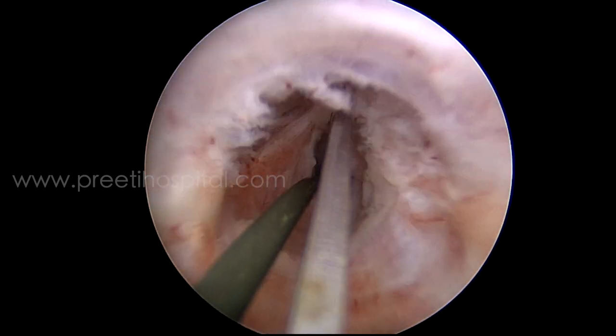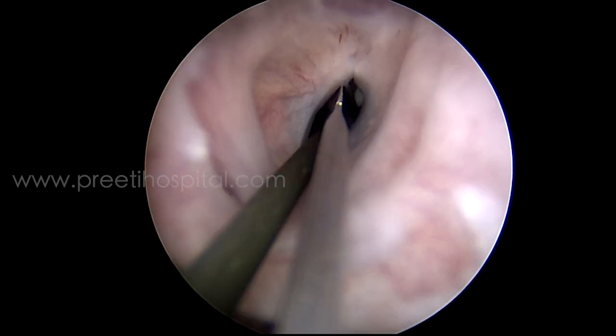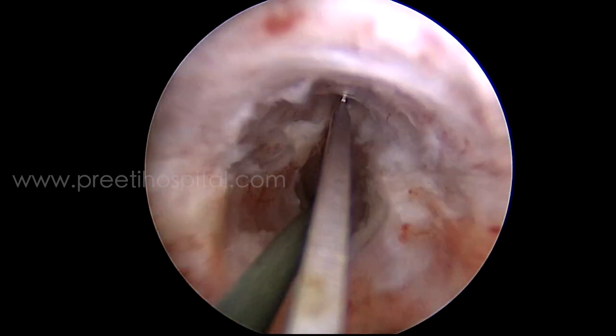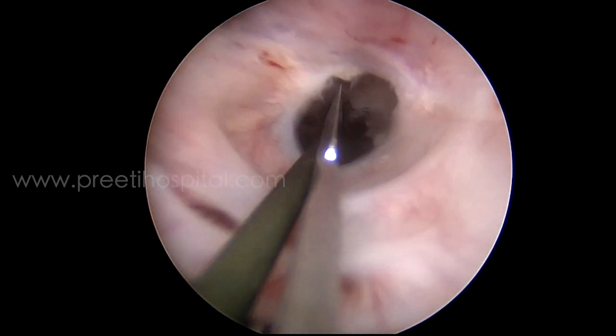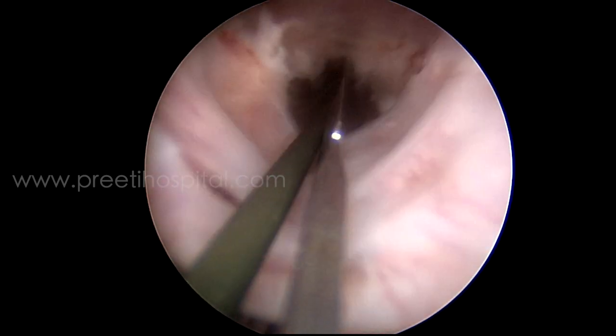You can see two small holes at the bottom, which are the effects of previous dilatation or previous OIU. If you go with your blade there, you will totally lose the track. Previously I shared one surgery where I lost the track, and then I could regain it by passing a guide wire from above through the SPC (suprapubic catheter) track.